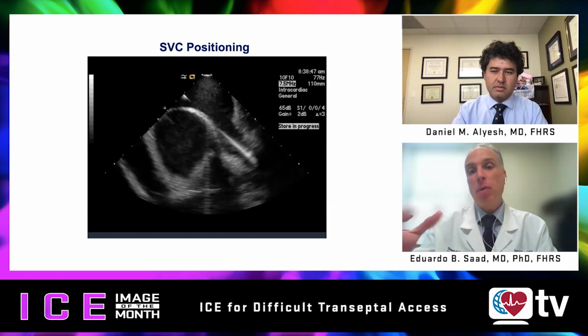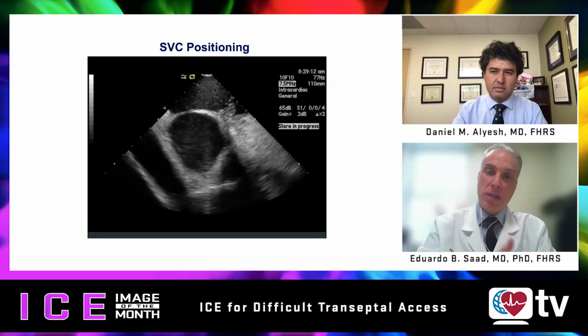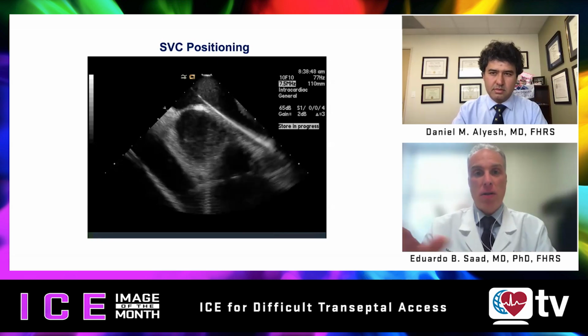So this is a very important maneuver for the initiation of the transseptal. From that point on, you're going to go down to the septum. So this is a very important confirmation, so we don't have any blind spots in our procedure.